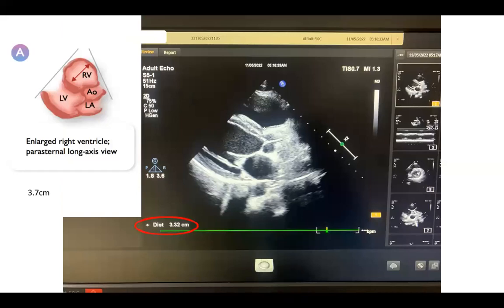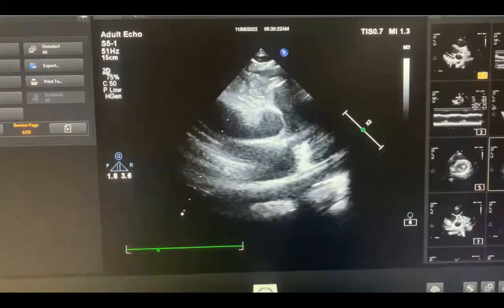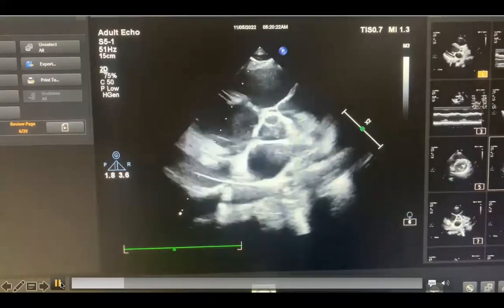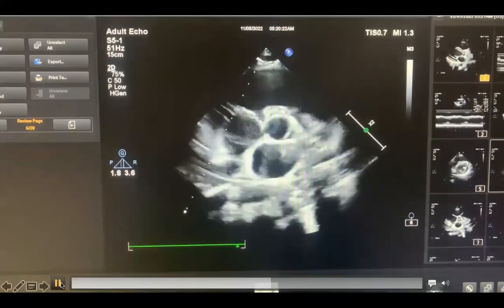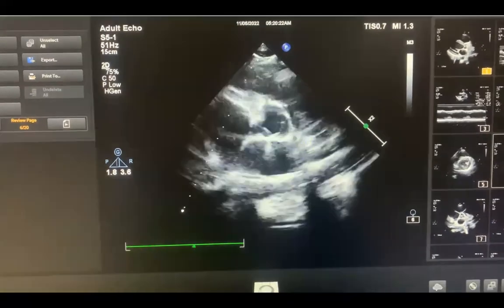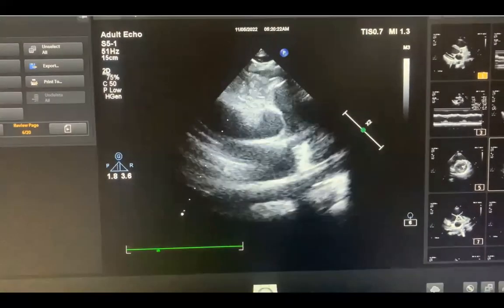You assess the right ventricle size in the parasternal long axis. In this case it was 3.3, and the normal is up to 3.7, so the right ventricle was not dilated. This is what you can get from the parasternal long axis view.